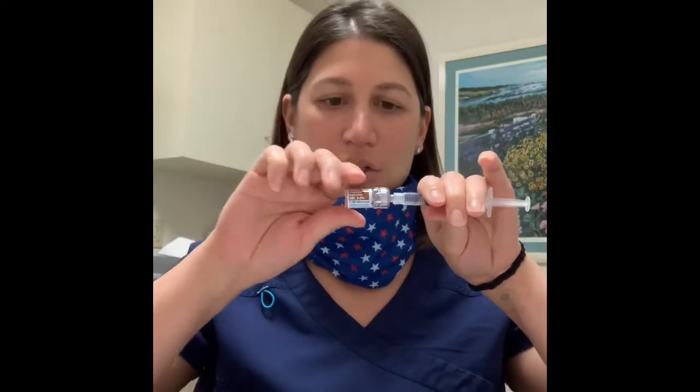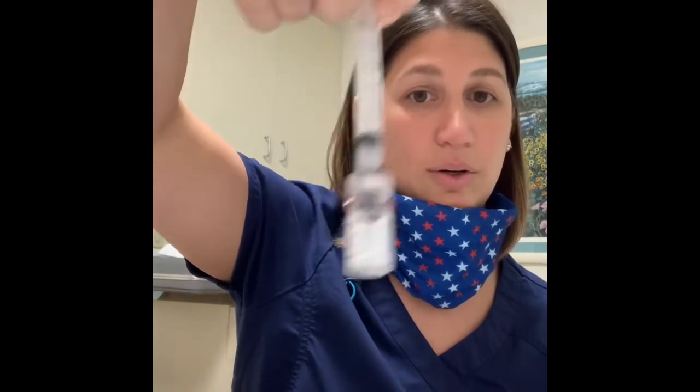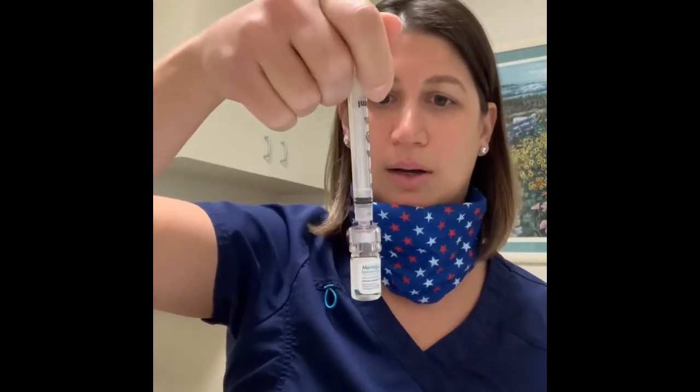Once you have your one cc of fluid, hold the syringe and pull the glass vial straight off, leaving the Q-cap on — the vial comes on and off very easily. Once you see fluid in the syringe, go to your Menopur vial, which says Menopur on it, has a peach cap, and has a chunk of powder in it. Take that cap off, push the Q-cap onto the vial, inject all of the fluid in, and swirl it gently. Do not shake it — give it nice little swirls, as if you're swirling coffee. Swirl it around and let it mix.